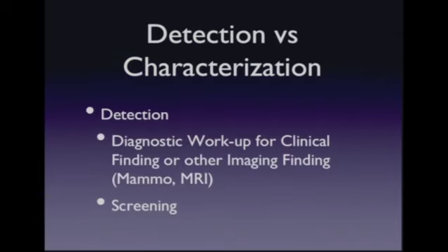The first thing that I think you need to do when you're doing a breast ultrasound is to decide if you're doing a detection exam, meaning that you're doing a diagnostic workup for a clinical finding or other imaging finding from mammography or MRI, or if you're doing a screening examination.